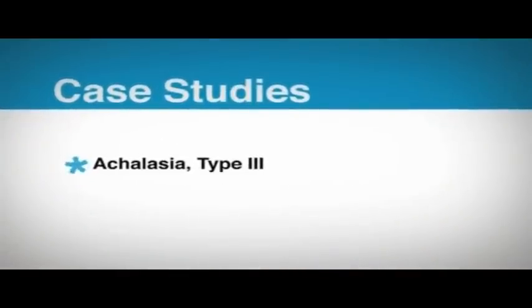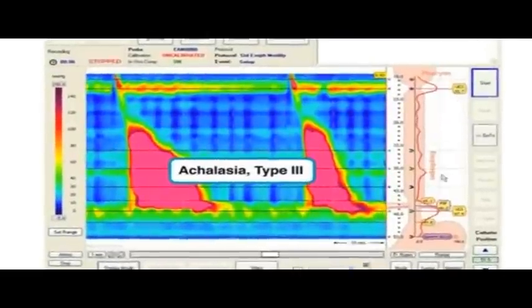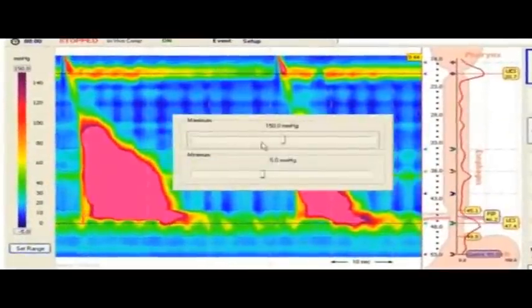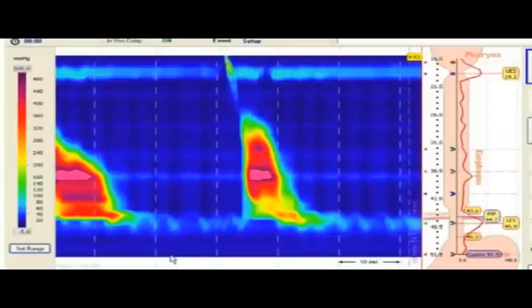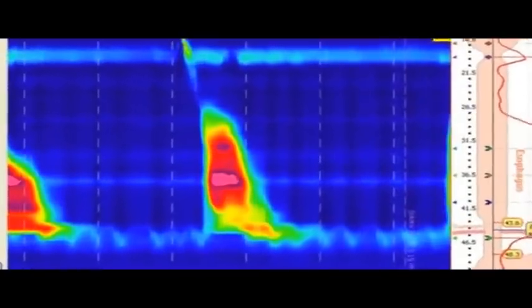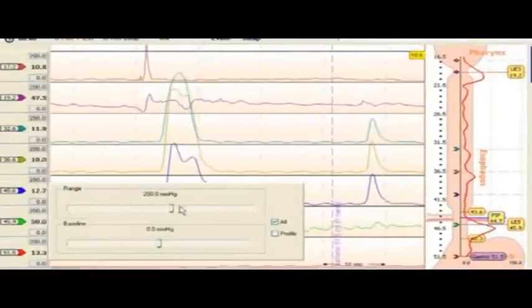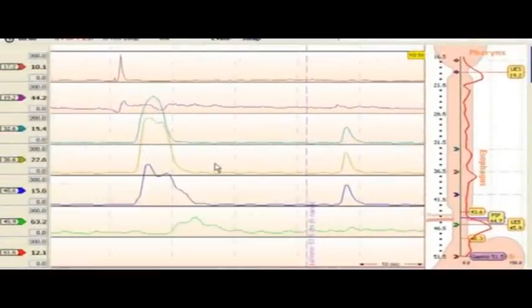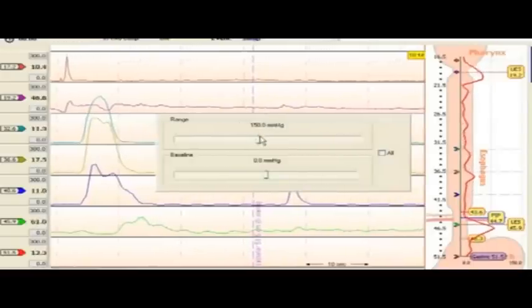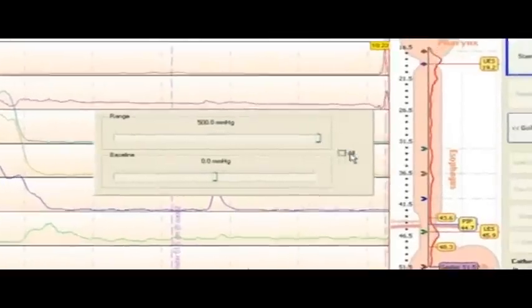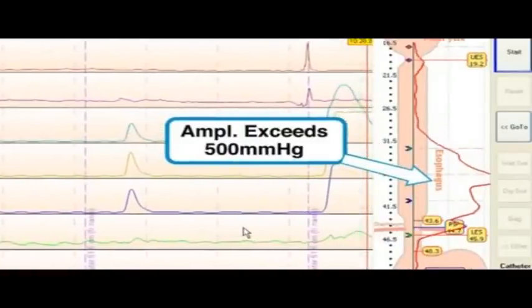Achalasia type 3. Adjusting the pressure scale, we see that peak pressures exceed 500 millimeters of mercury. We similarly adjust the line trace amplitudes. Note that the LES does not sufficiently relax. And observe the high wave amplitude in the pressure profile display.